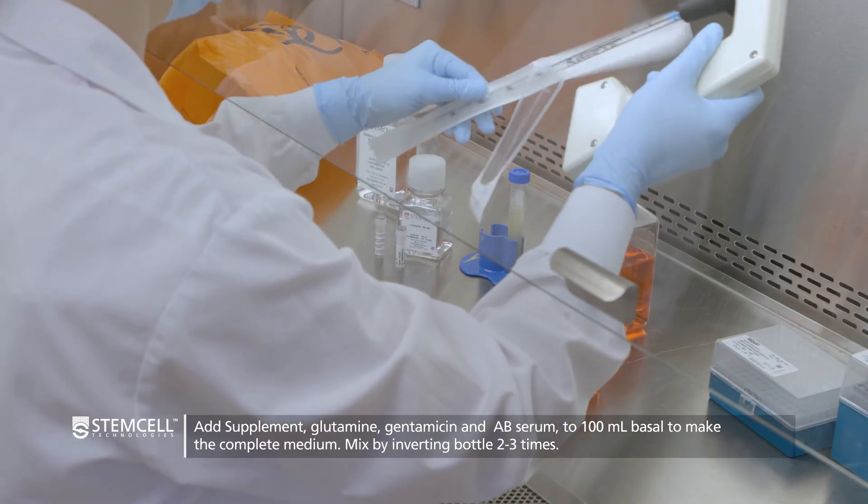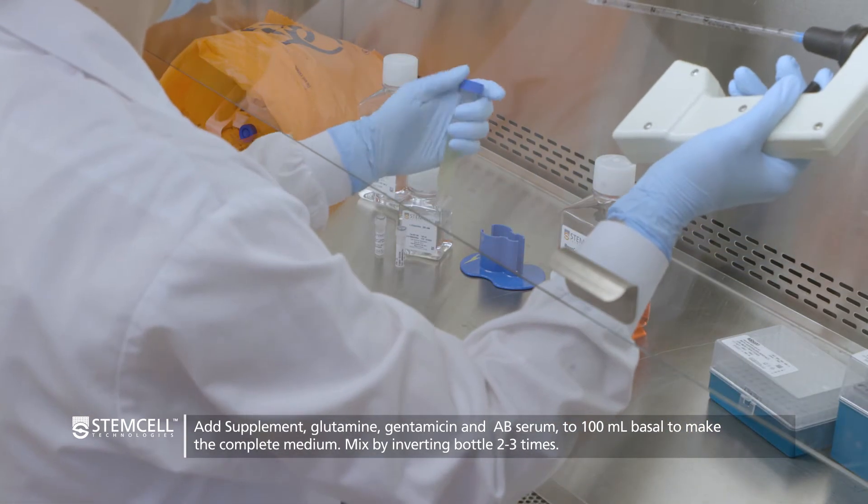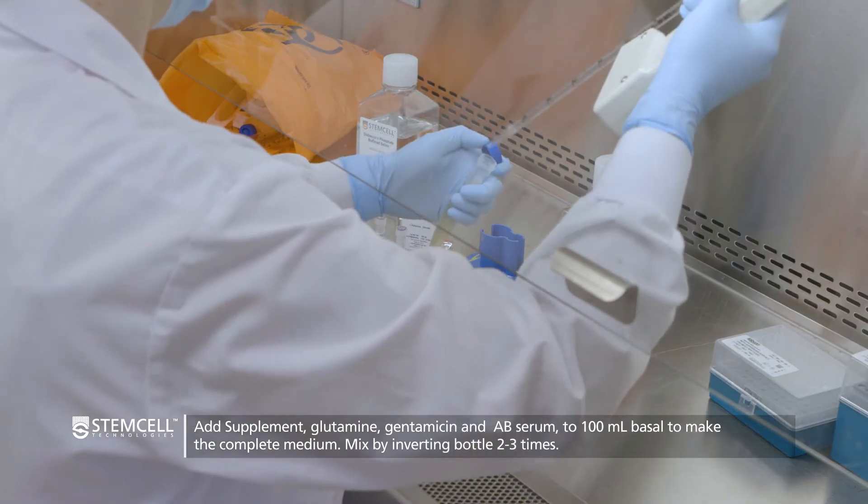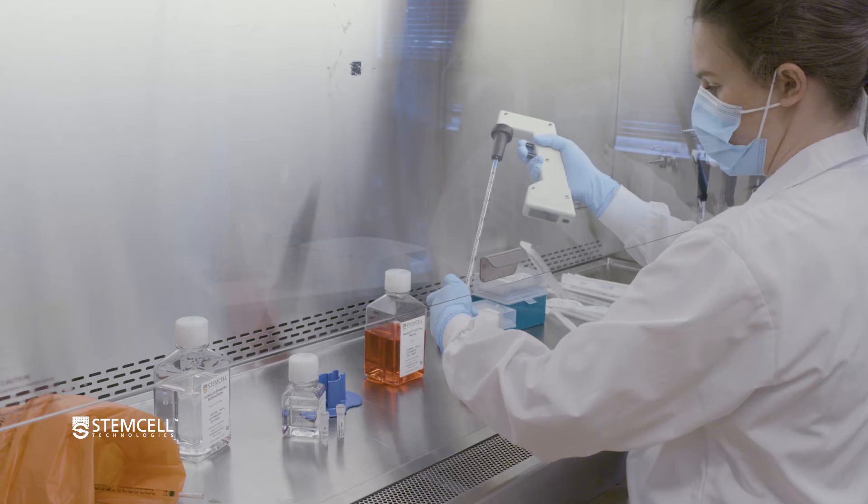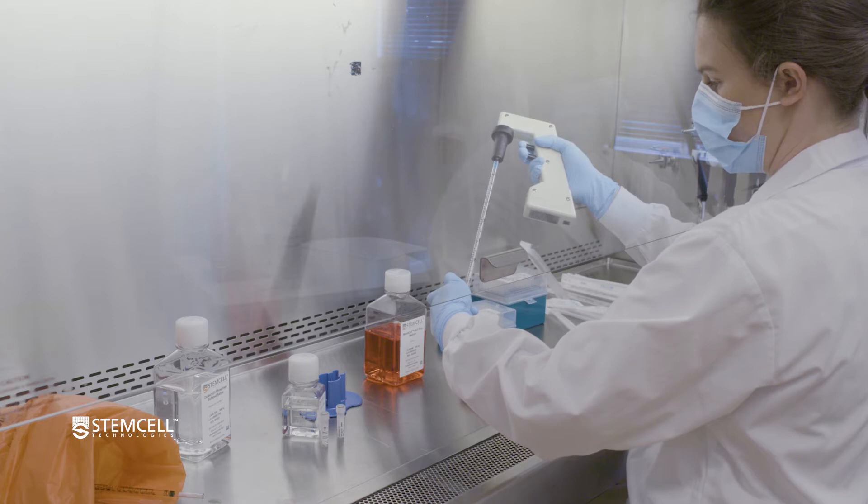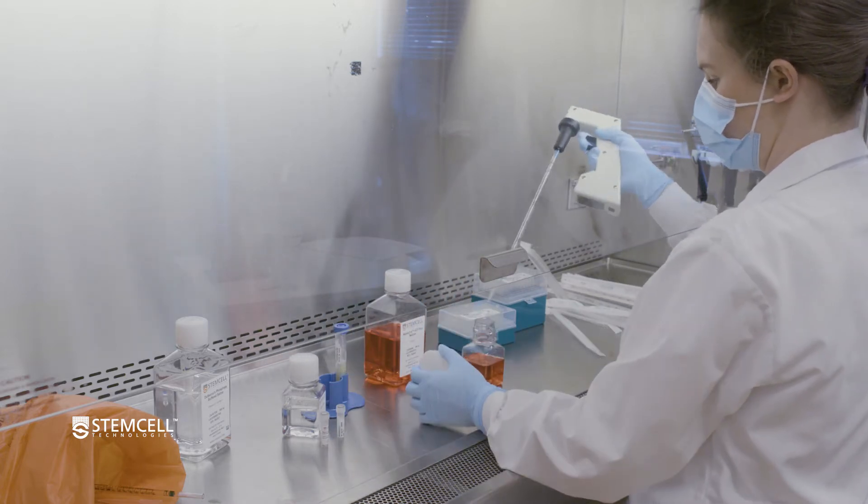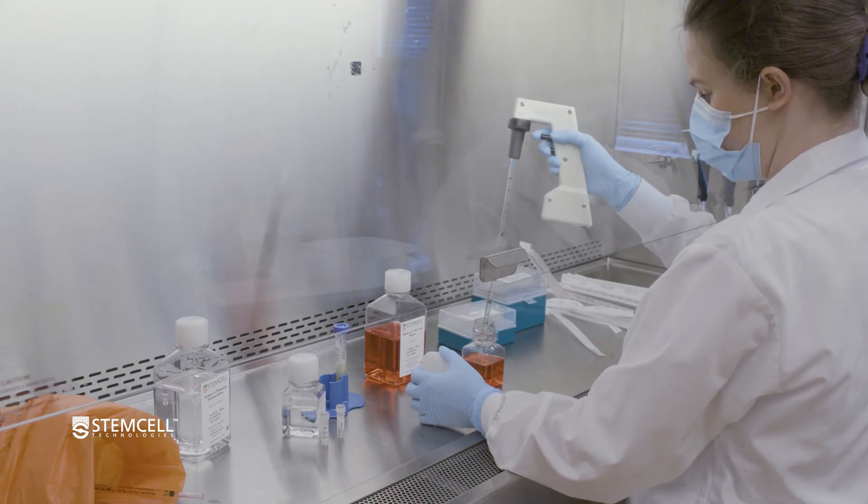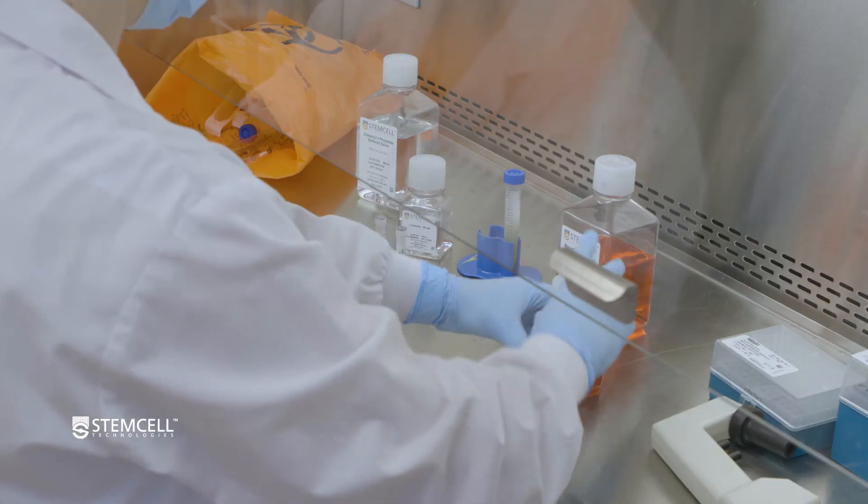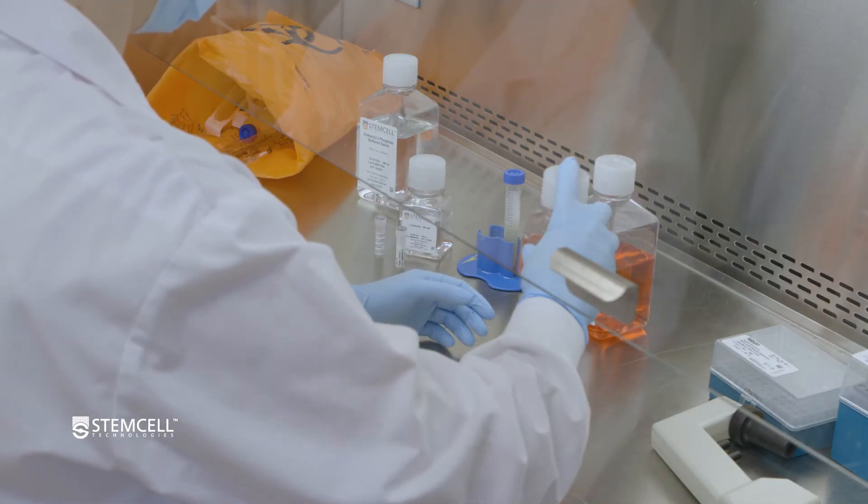Add 2.5 milliliters of Human AB Serum for highest yield results. If you are not adding AB Serum, top up to 100 milliliters with an additional 2.5 milliliters of MesenCult ACF Plus Medium. Mix by inverting the bottle 2 to 3 times.